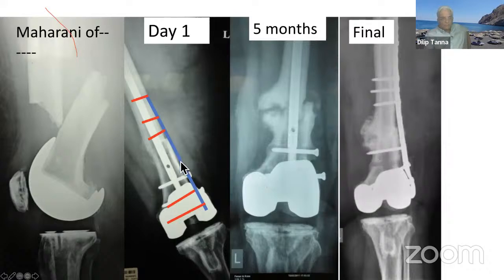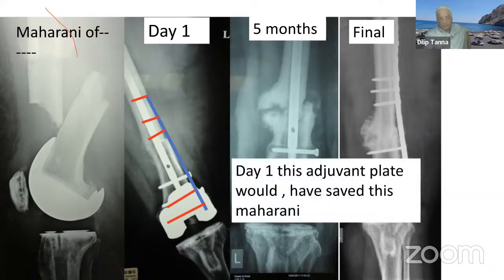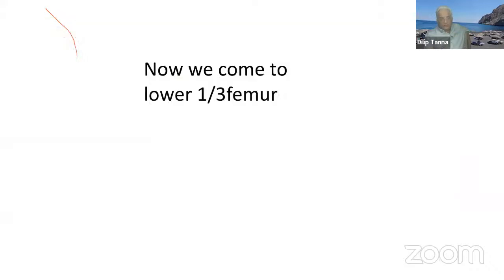On day one, if he had done this nailing and put in this plate, because this is the poor construct, this patient would have gone through a perfectly normal life and nothing would have happened. All these things would not have occurred. Day one, this adjuvant plate would have saved this patient.